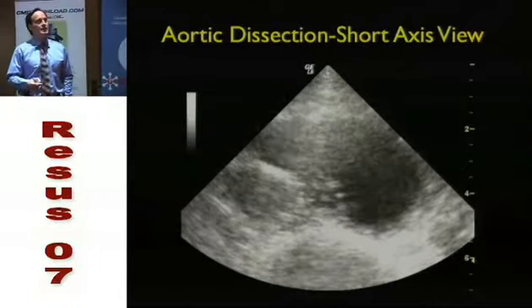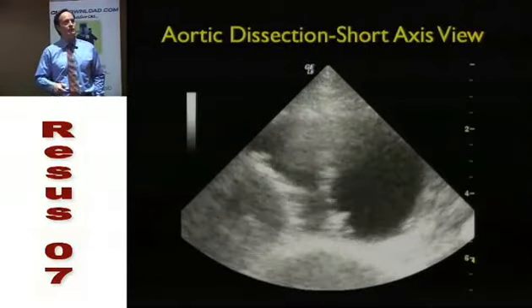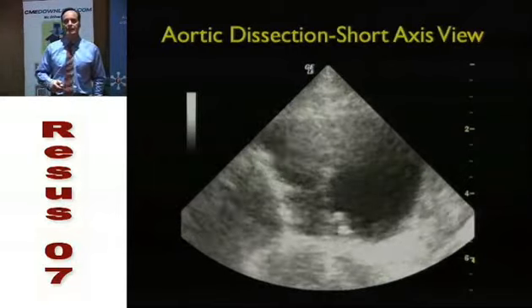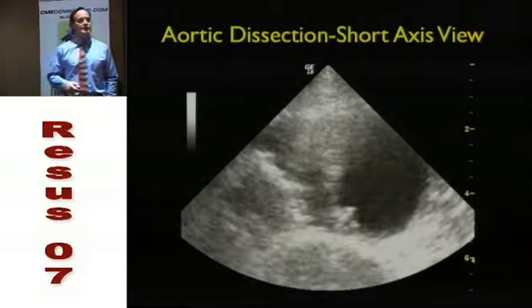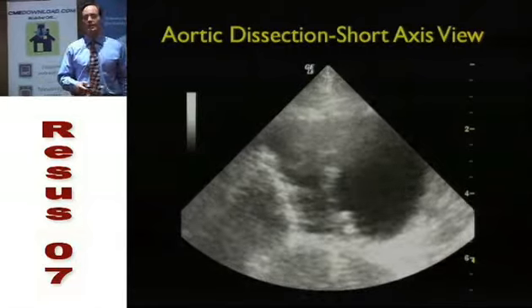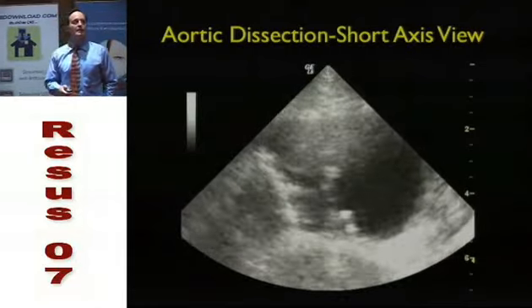Now, you can see here, this is a large aorta, right? Because here's the marker dots. You see it's about 4 centimeters. But do you guys see this thing going all the way down here? There's actually a flap coming all the way down the middle of the aorta. So this is the dissecting thoracic aortic aneurysm that was coming down past the diaphragm into the abdomen, okay?